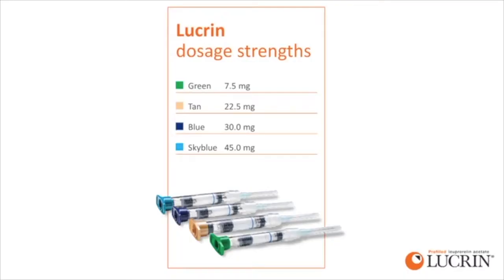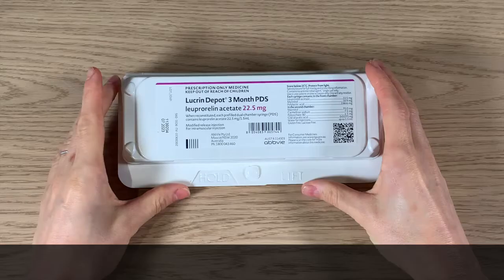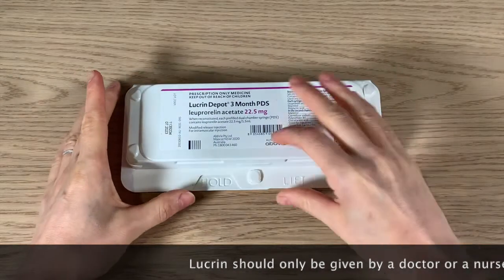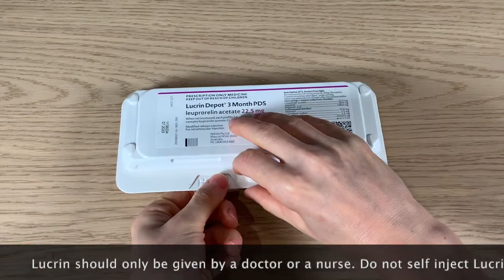Lucrine comes in various doses and these work for set periods of time. Please check the correct dose has been given — the packet has doses and duration of action marked on it. Here we are using a 22.5 milligram three-month dose.